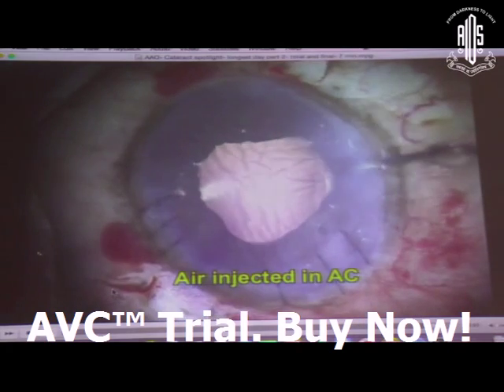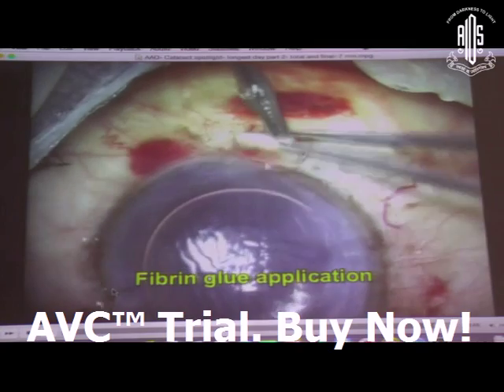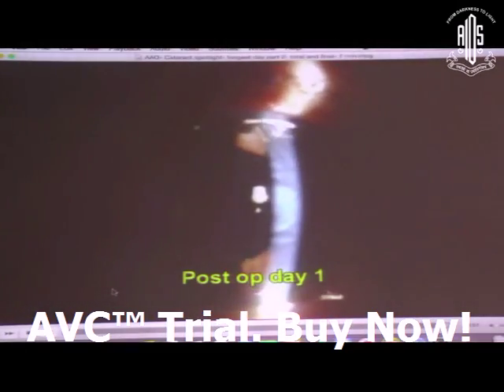All I have to do is now suture up the clear cornea incision, apply the fibrin glue, and seal everything down. And this is how the case looks when it's completed. And that's the post-operative day 1.